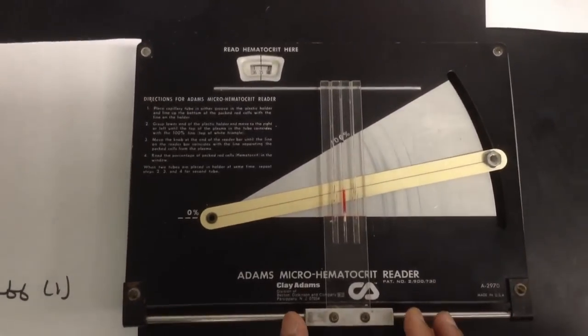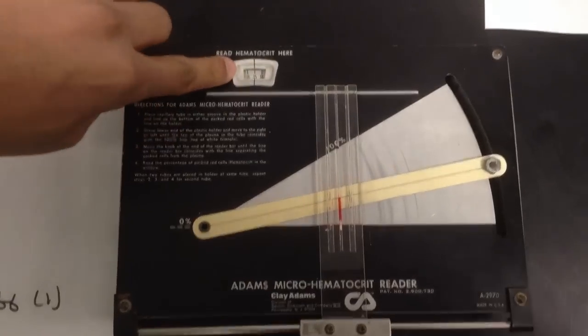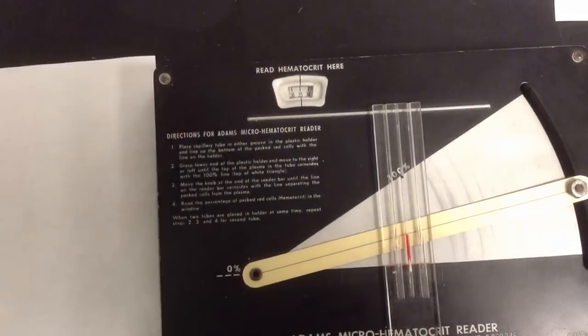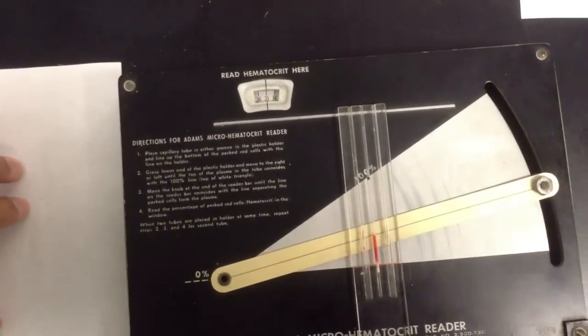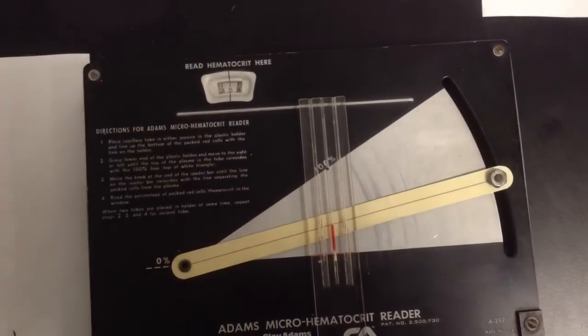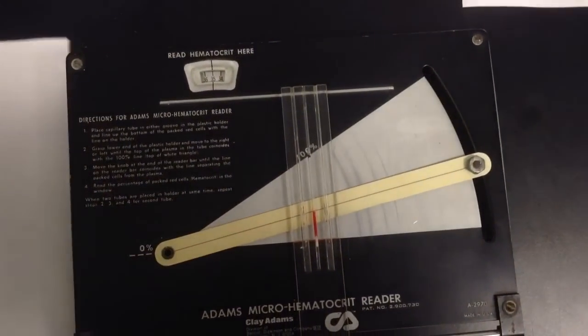And that's the perfect level we got and it is 35 hematocrit level. So that's your hematocrit level. That's how you get it.